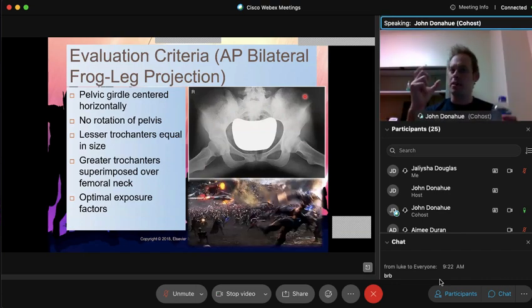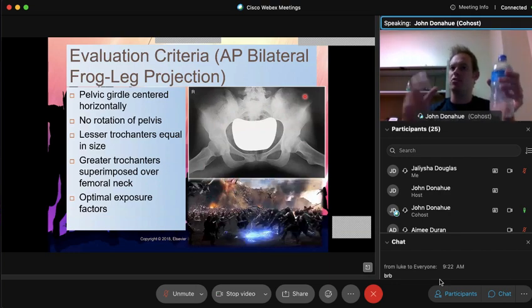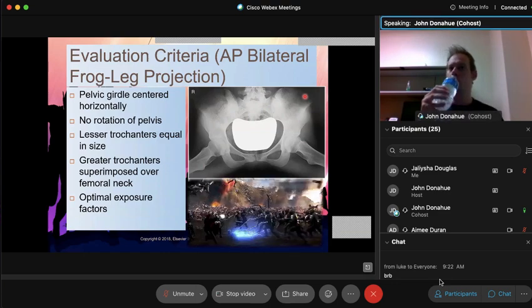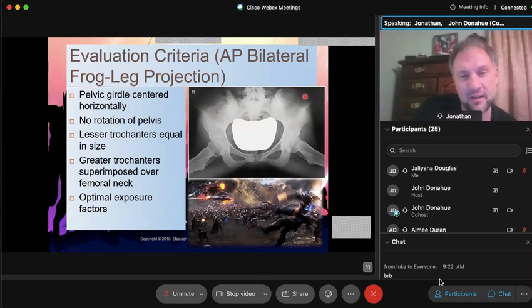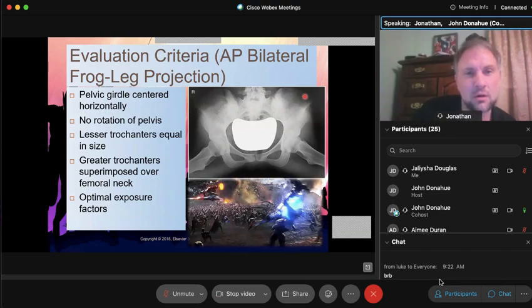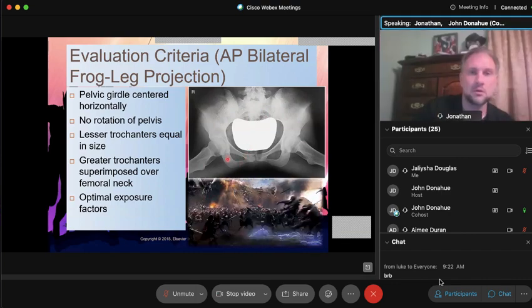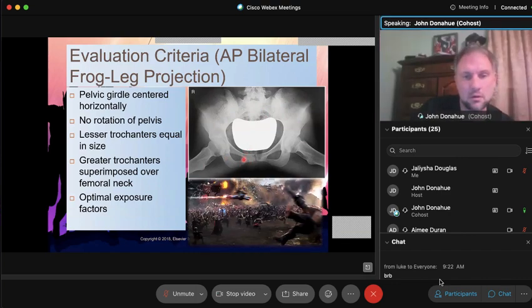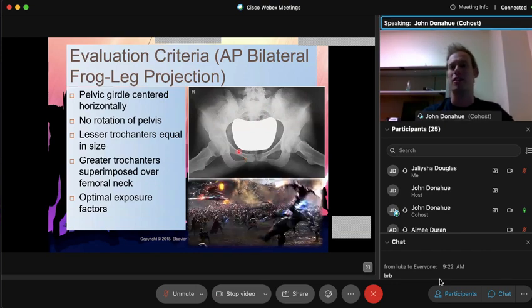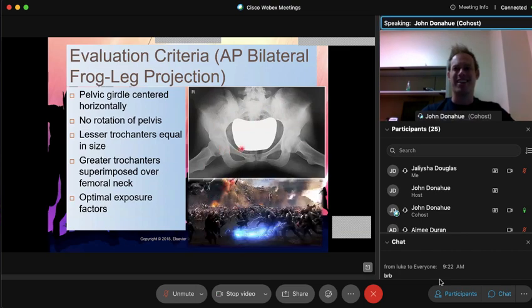And you always want them to be completely open, of the exact same shape and size on either side, to show you the truth. Would you say this one is a little oblique? Just looking at it, it looks like the one on the right is a tad bit smaller. Very good eyes, Jonathan. It is, very, very slightly, not much. This would not be enough to repeat. It's starting to close just a tiny bit. Good eyes on that.